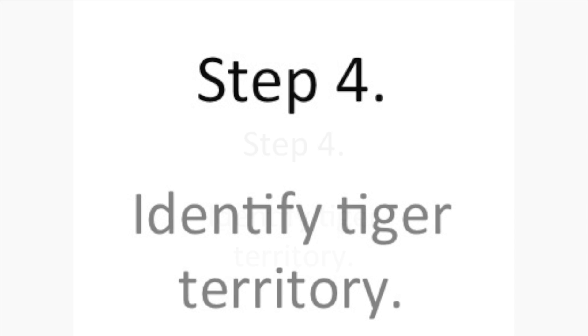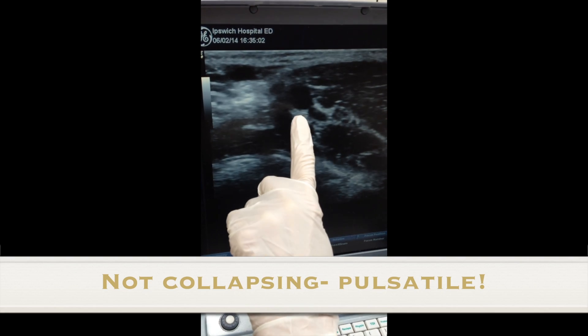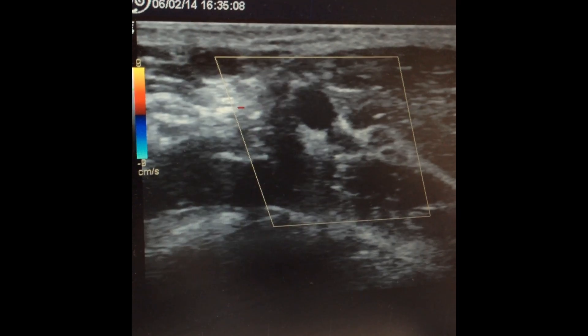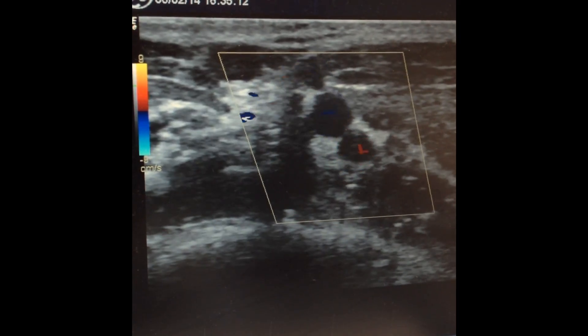Step four is check out the neighbours. Find the proximal arteries — they're the ones that don't compress and pulsate. If you put the colour flow on, you'll see occasional flow in the veins but a regular pulsation in the artery.